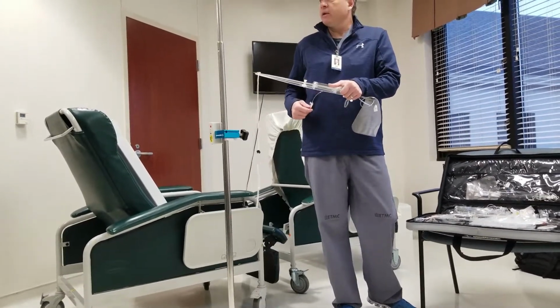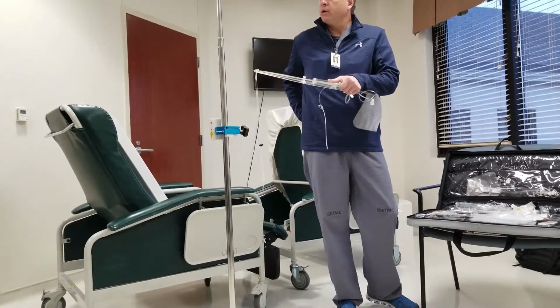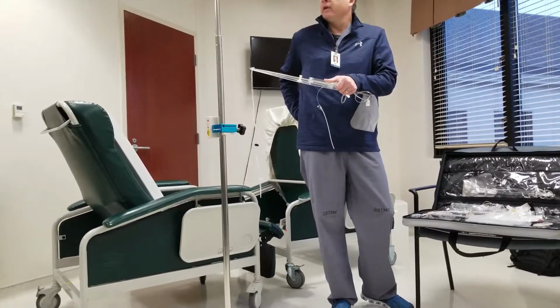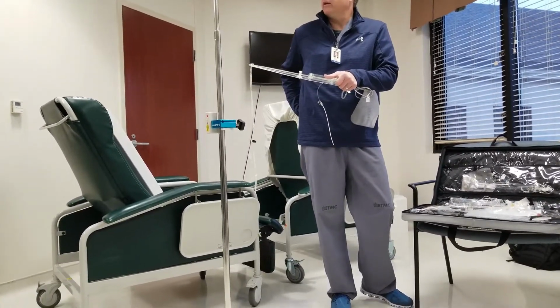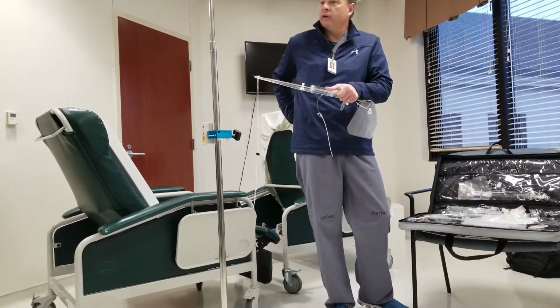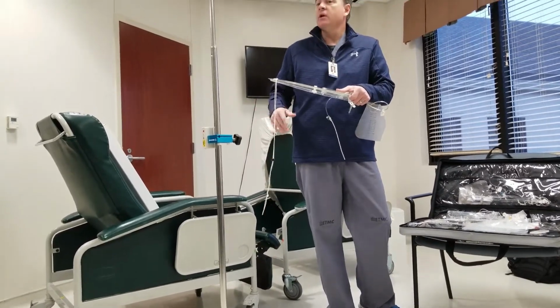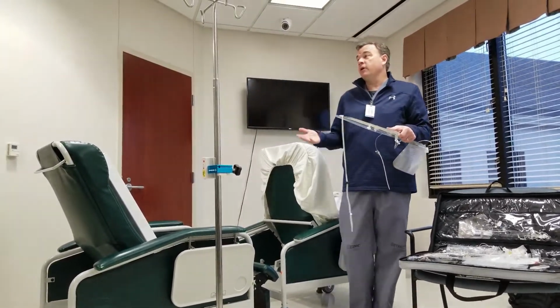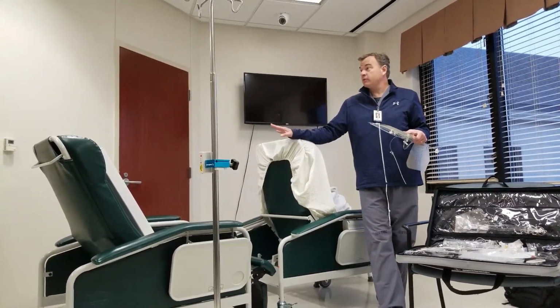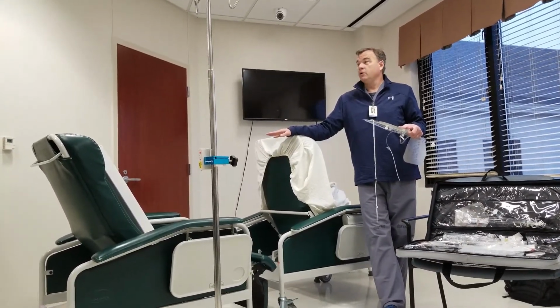It takes the body a little bit of time to heal. What you don't want is for the catheter to be pulled out, the puncture site still open and trying to heal itself, and then 20 minutes later she has a whole bunch of water and has to go to the bathroom. She stands up, and now you've got another dural defect because of the spinal canal, gravity and pushing. So if they don't have a Foley, you want them to go to the bathroom first, because once whoever it is takes it out, the orders are 6 hours horizontal, no getting up.